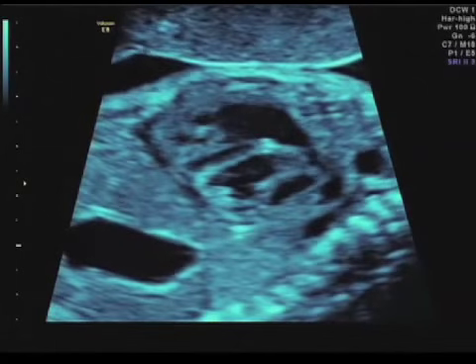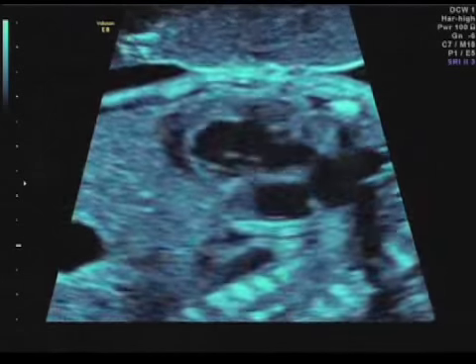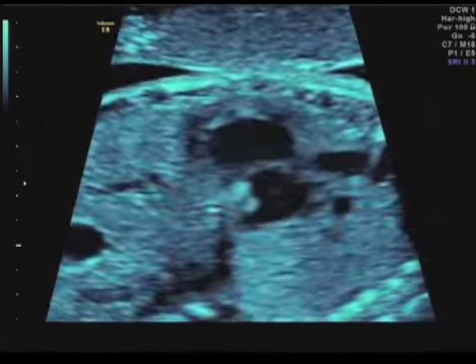And in the sagittal, you see the same large right ventricular sinus, narrowed right ventricular outflow tract, and where the pulmonary valves should be, you see the little buds, and here it measures about half the size of the aorta. IVC and SVC are well seen.